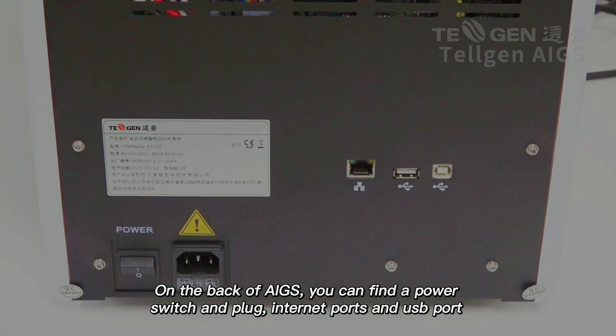On the back of AIGS, you can find a power switch and plug, internet ports, and USB port.